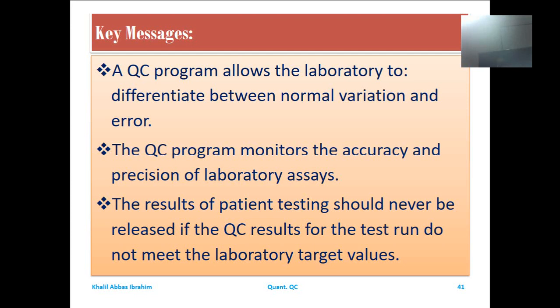The QC program monitors the accuracy and precision of laboratory assays in what is known as quantitative laboratory services. The results of patient testing should never be released if quality control results of the test run do not meet the laboratory target values. When the control values lie outside the target value, outside the accepted range of quality, no issue of results should take place.